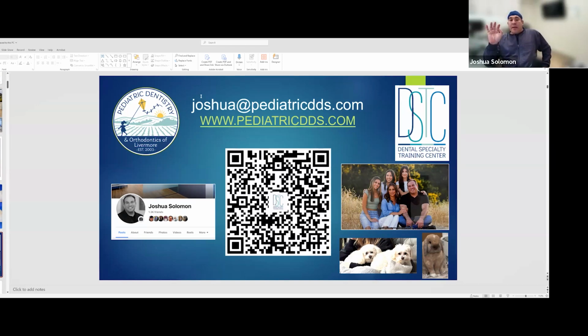Now, I would say I don't give a lot of blocks in my practice anymore. I was thinking about this the other day. Even 18, 19-year-olds, it's not guaranteed, but typically females, not always, but females may have a cortical plate of the bone that may not be as thick. But if I have a 19-year-old big linebacker guy, I'm usually not going to pull out my unit. Okay. So that's the first thing. I would say 14 and under, I don't have a problem giving that using manual bone penetration.